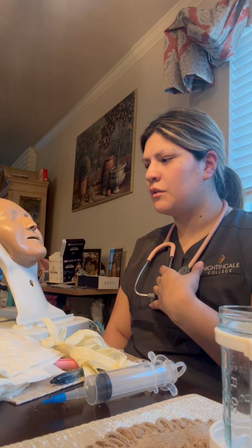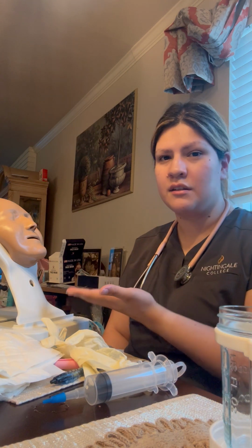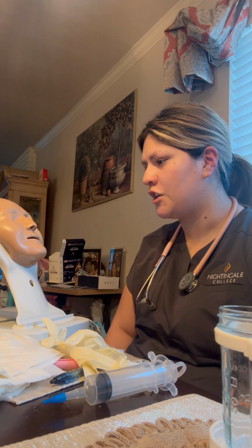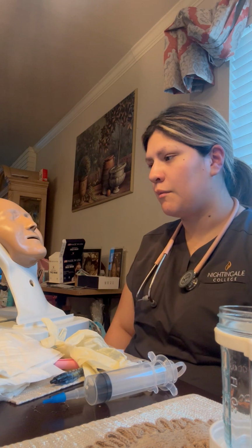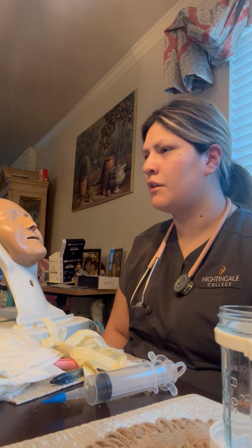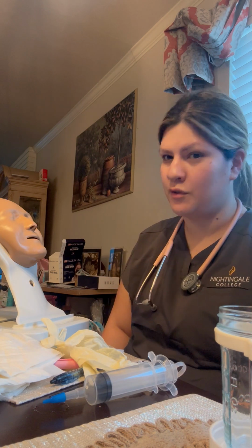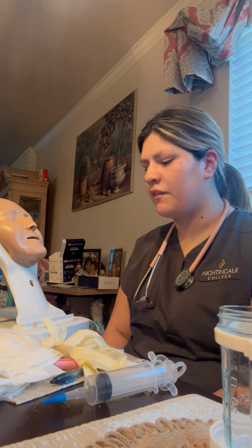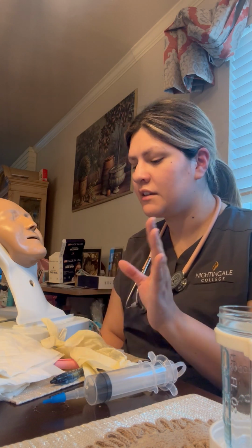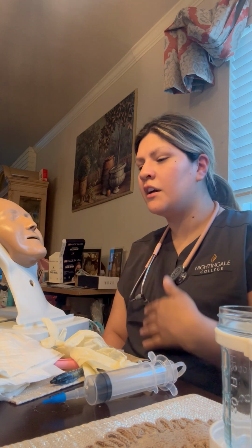I'm going to introduce myself to the patient. Hi, my name is Janelle. I'll be your nurse today, and I'm going to go ahead and do the NG tube. Can you please tell me your name and date of birth? Patient's name is John Smith. Date of birth is 1/1/2001. Okay, perfect. I'm going to go ahead and check the patient's wristband, checking the two identifiers. They are who they say they are.